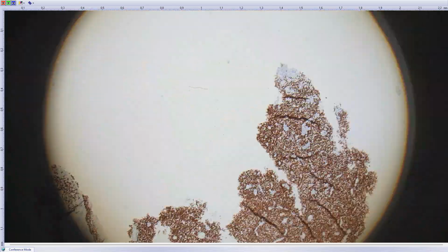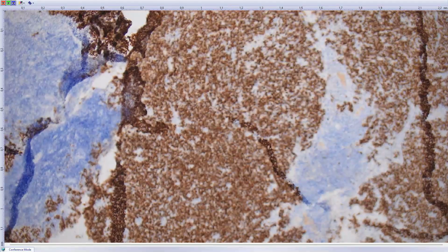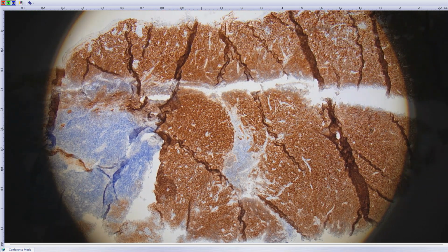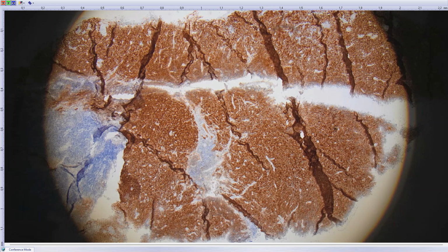It's this non-keratinizing squamous cell carcinoma. This is p40 staining. So all of this solid-looking tissue is not lymphoid tissue, it's epithelial. This is p16 staining, which confirms it's HPV-associated oropharyngeal squamous cell carcinoma. It's not graded because, in spite of having this undifferentiated basaloid morphology, it is in fact well differentiated and shows a very good prognosis, even in cases which are metastatic.